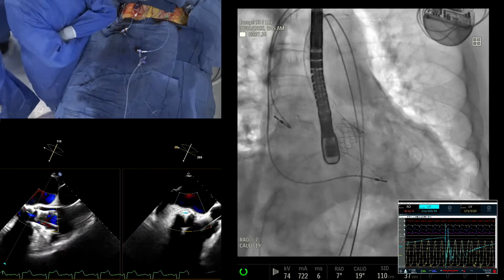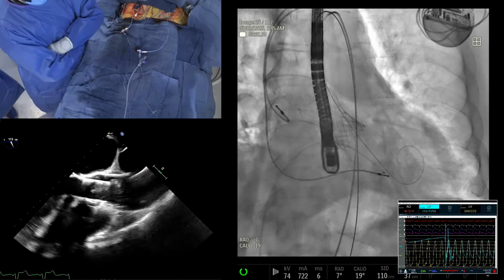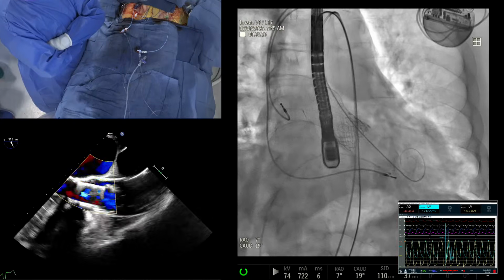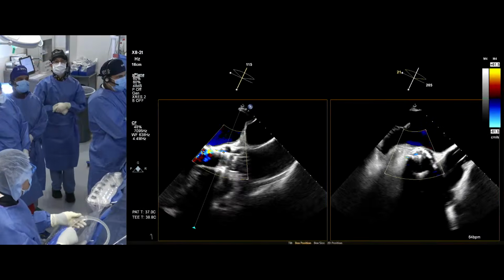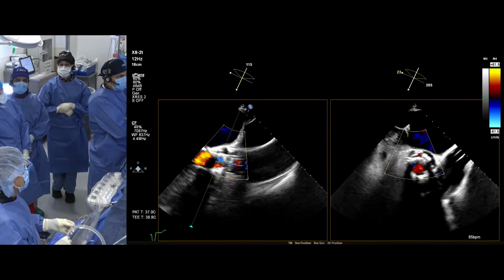Okay. So, on short axis, remember you showed us some area measurements? Can you show us that same area measurement so we can assess pre and post quantitatively? And how does the AR index look on the hemodynamics? We should probably show that as well. No, bring it down. Bring it towards here. Towards me, Prof.